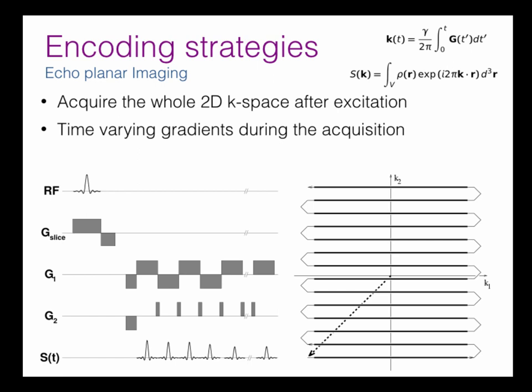Okay, so this is pretty much the fastest conventional acquisition method there is. It basically acquires the entire scan after a single excitation. The limit on what you can acquire with this is that the whole time you've just got this one excitation, so the signal's dying away by T2 star decay.